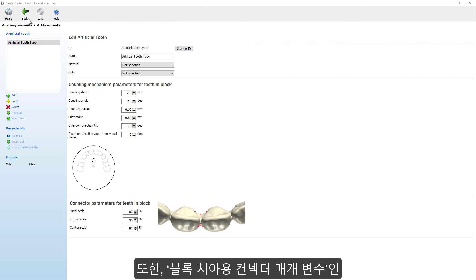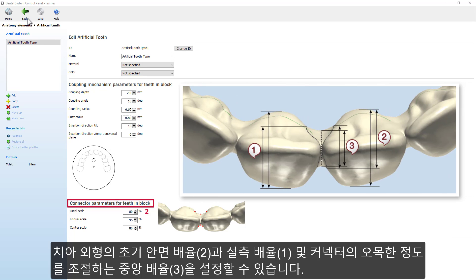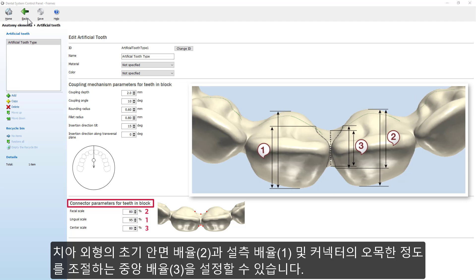As well as set the Connection Parameters for teeth in block, like the amount of facial scale from its initial shape taken from the tooth silhouette, the amount of lingual scale from its initial shape taken from the tooth silhouette, and the amount of the connector scale controlling its concavity.